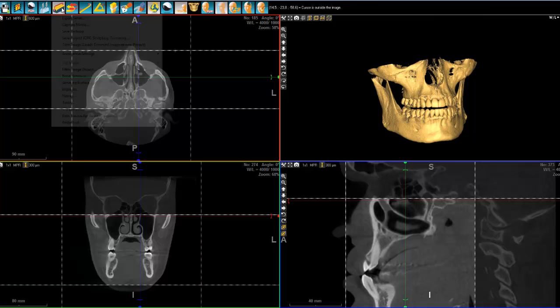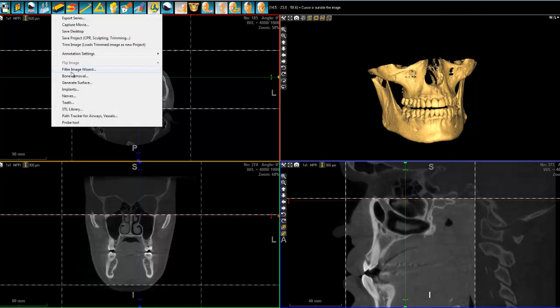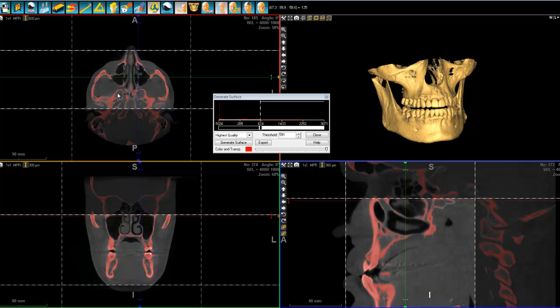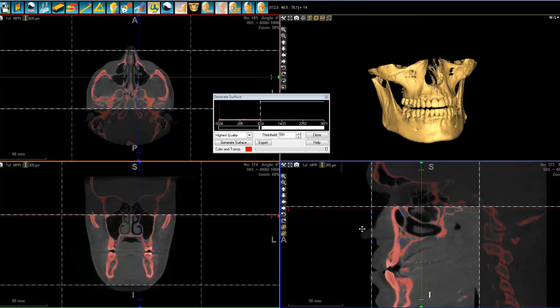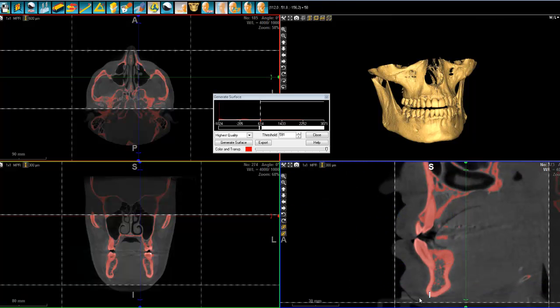Then you simply come here to Tools and select Generate Surface. Here, everything shown in red is the surface that is going to be taken into account to generate your surface — everything in red will be generated as a surface.